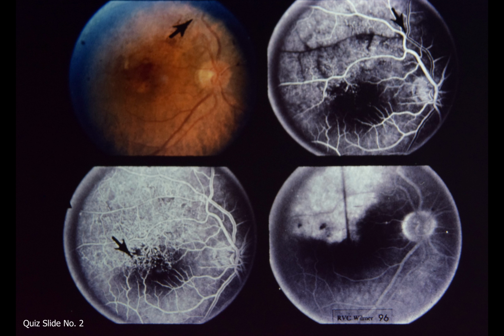Upper right, 14 seconds after dye injection, arrow indicates site of obstruction. Note absence of laminar flow in venule distal to obstruction site, while laminar flow is seen clearly in venule proximal to site of obstruction. Lower left, 20 seconds after injection, arrow points to dilated capillaries shunting blood across horizontal raphe to circumvent obstructed vein. Lower right, 20 minutes after injection, note extensive leakage from dilated capillaries and well-developed cystoid maculopathy.